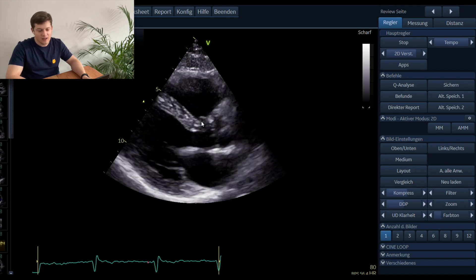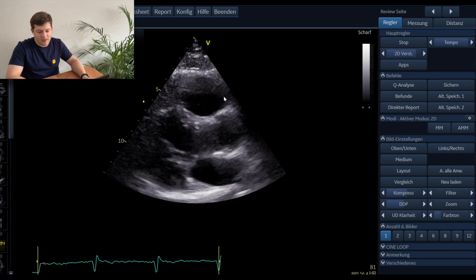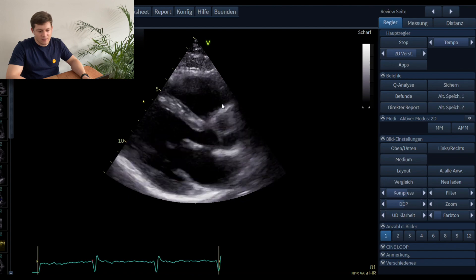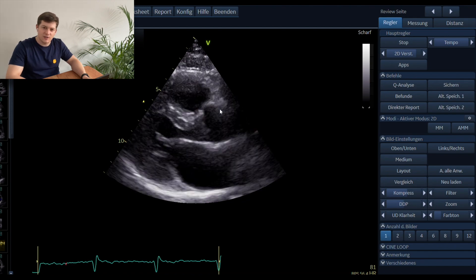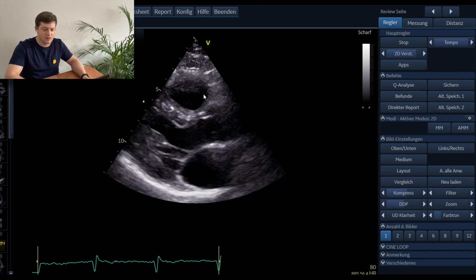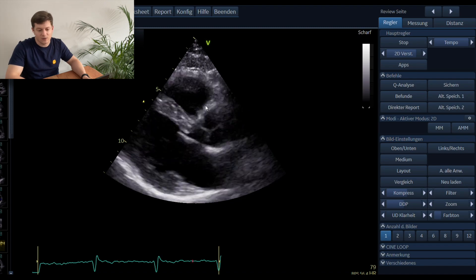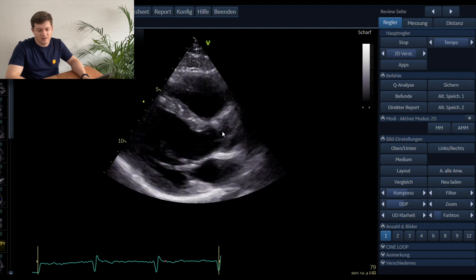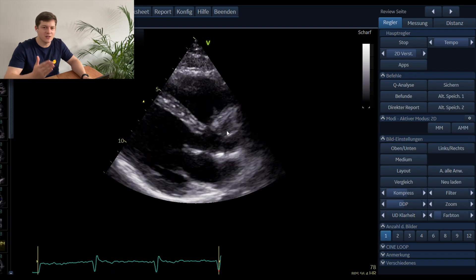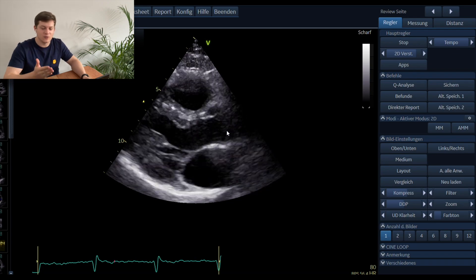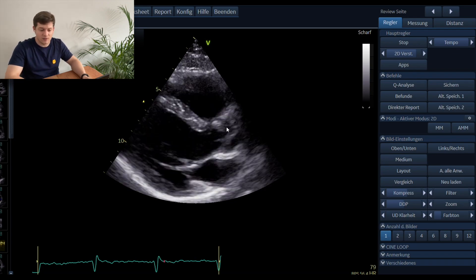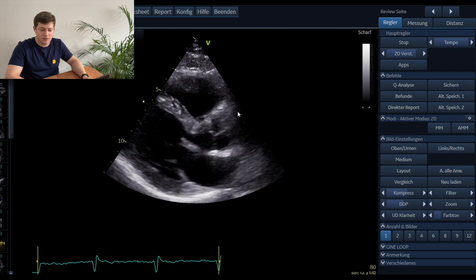To continue, here you have the left ventricular outflow tract — the LVOT — and already here is the aortic valve. Here you have the right coronary cusp, always towards the right ventricle and the right heart. And here this is the left or the non-coronary cusp, depending on the angle towards the aortic valve. Up here would be the ascending aorta.